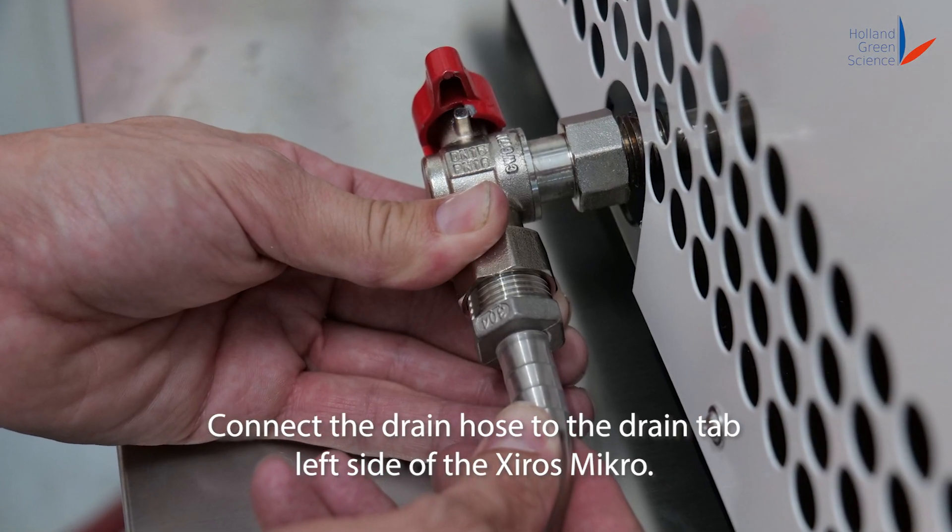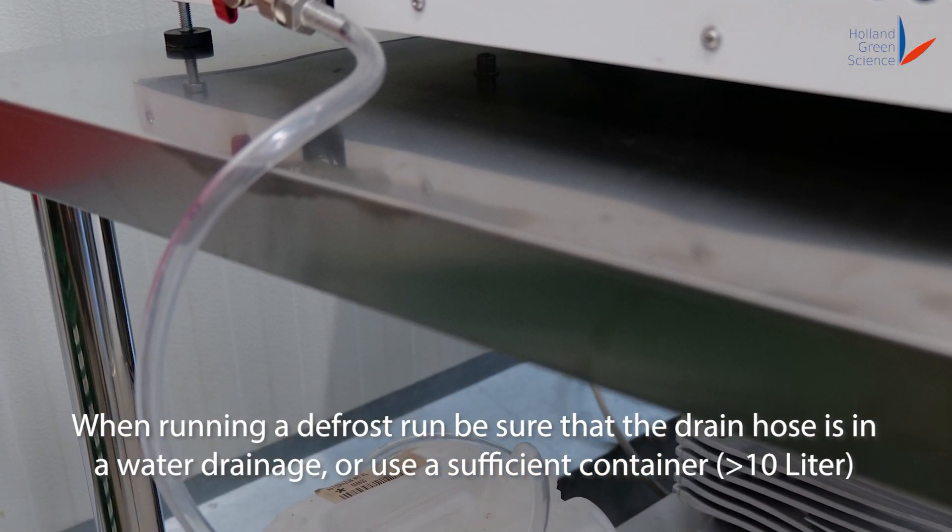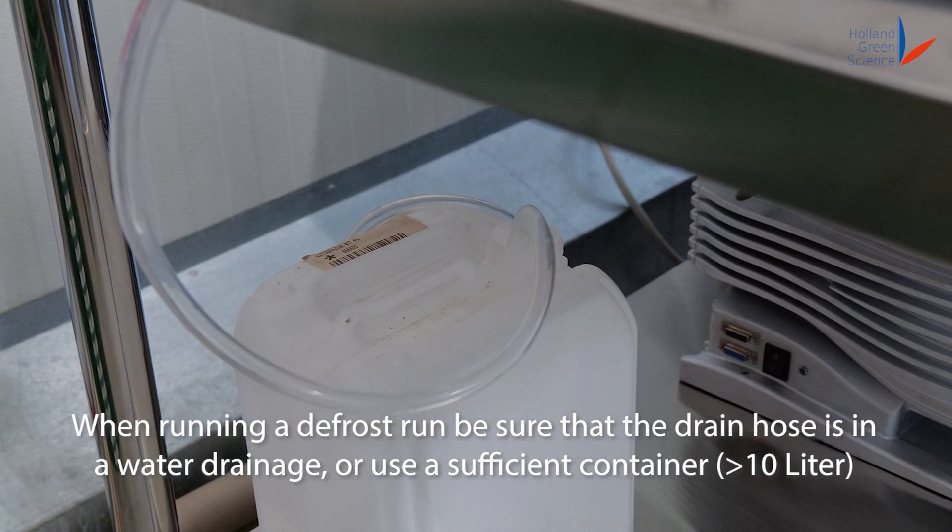Connect the drain hose to the drain tab on the left side of the Shiro's Micro. When running a defrost run, be sure that the drain hose is in a water drainage or use a sufficient container.